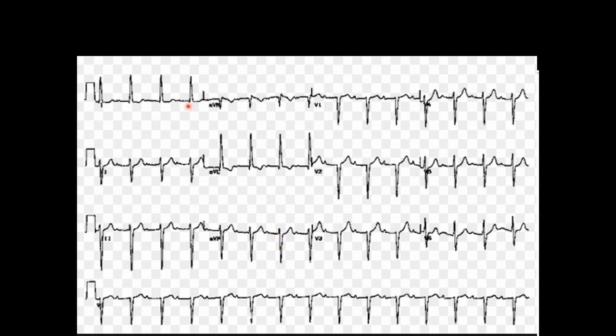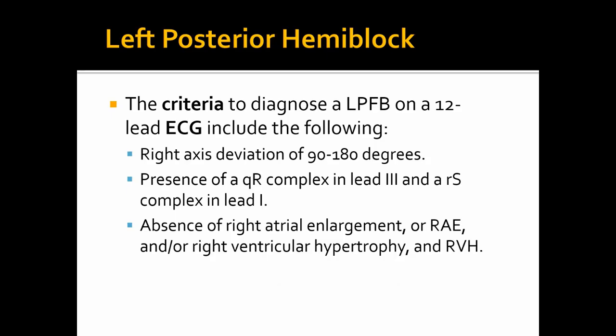There is a small Q and a large R in lead 1, and there is a left axis deviation as well. So this is left anterior hemiblock. Next block is left posterior hemiblock.